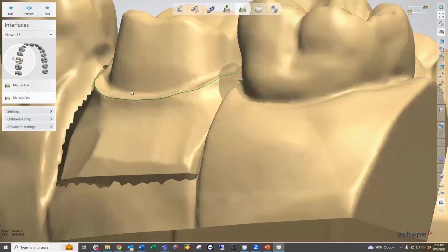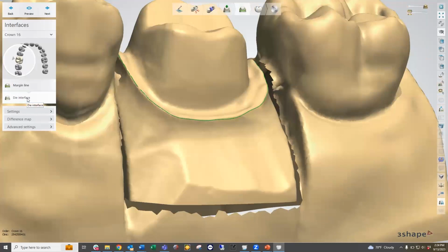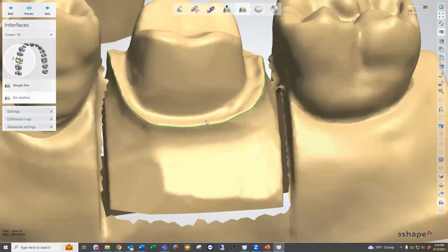And now we're talking about the die interface. The die interface is going to be the cement gap that we see between the unit and the die that we have here.